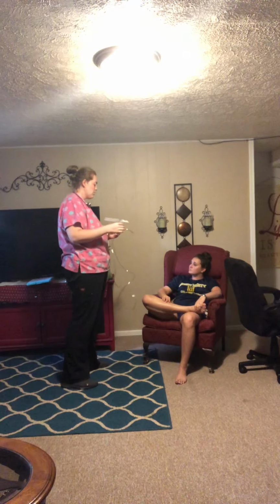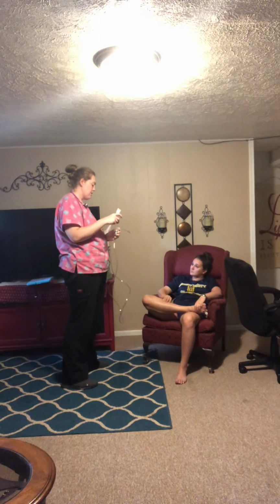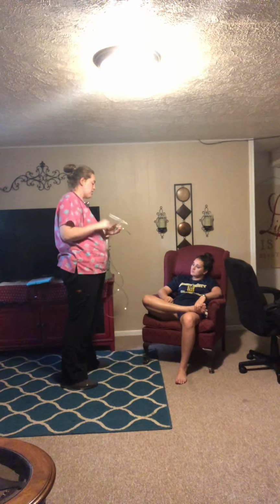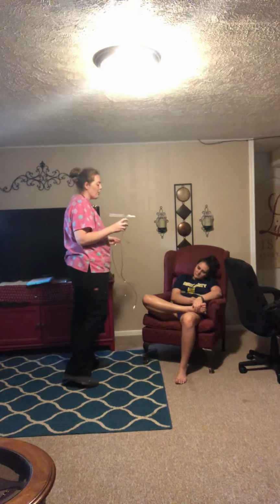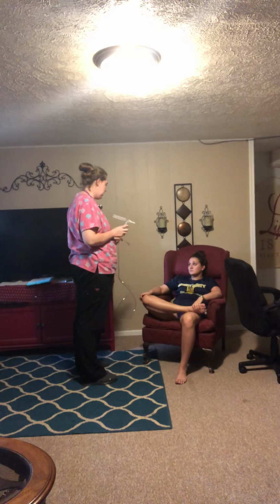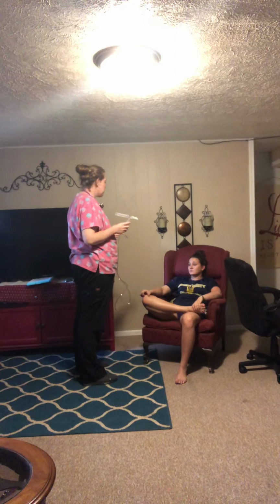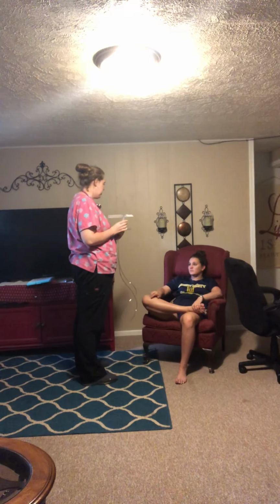The first thing you need to do is just go ahead and put the medication in. You can put it in right through here on the top. It's one of the easiest ways. And then you just need to make sure that it's plugged into the air compressor as well as the electricity. When you turn it on, you're going to see a mist coming out of the ends, and you're going to just go ahead and breathe normally. Every 3 to 5 breaths, you'll take a nice deep breath in, and then continue with normal breathing. And then when it starts to sputter, you'll hear that sound, and then you know that it's done.